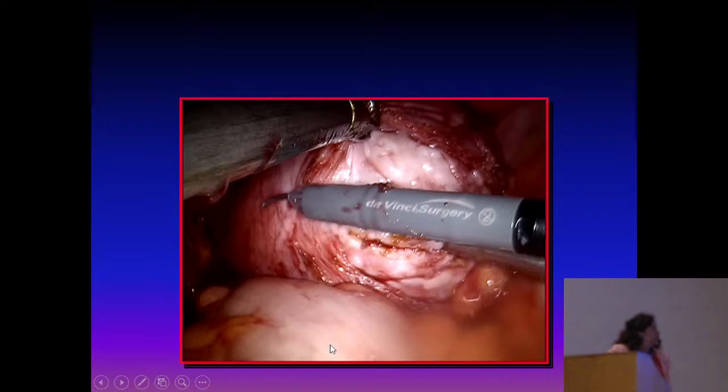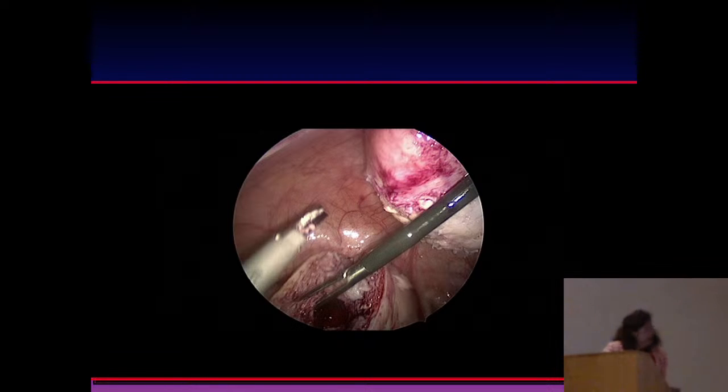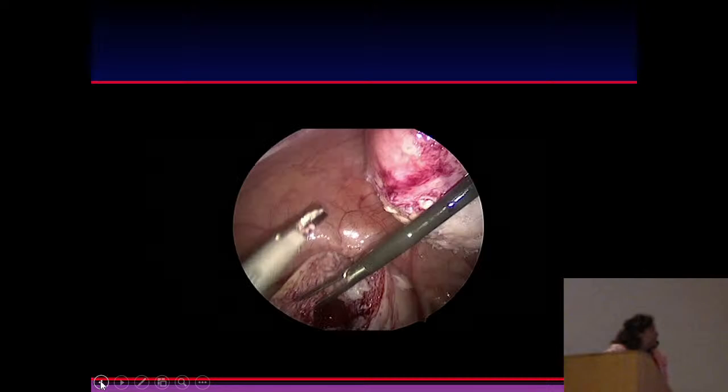So at the time of surgery, you clearly saw 2 fibroids, so you want to remove the one at the fundus, and then the second one, you would expect it was submucosal, so you entered the cavity. But if you are doing a laparoscopic case as well, you're still not going to remove the other one hysteroscopically, and then you repair and suture the cavity.